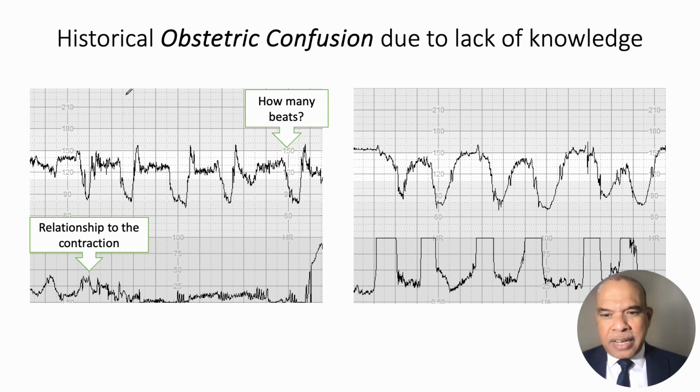The good example I can give you is that in the gym, when you are breathing faster, imagine a retired obstetrician like Edwin Chandraharan comes and gives you oxygen, because they don't understand that the increased respiratory rate and depth of respiration in the gym is your physiological compensation. In the same way, fetal heart rate intermittent decelerations are cardioprotective reflexes. They are the fetal counterpart of adult respiratory rate.